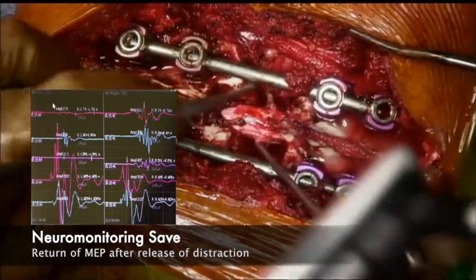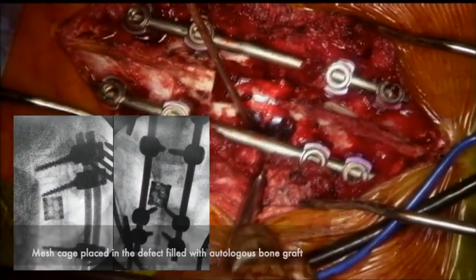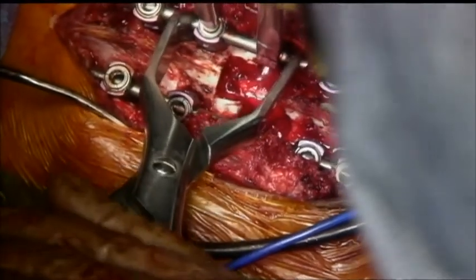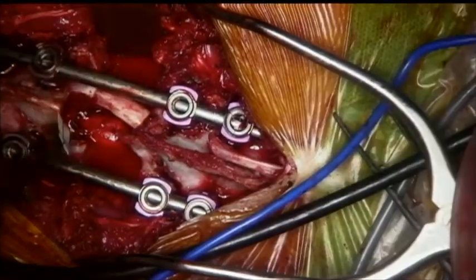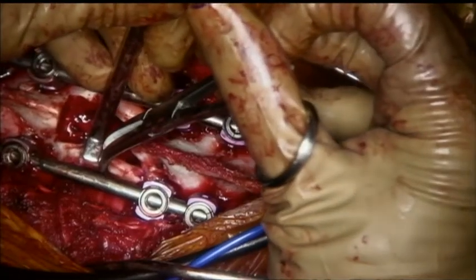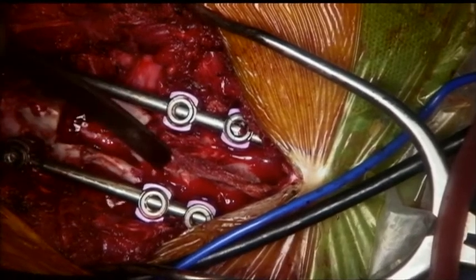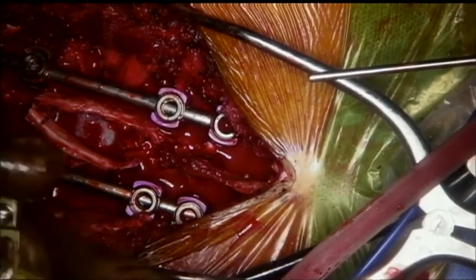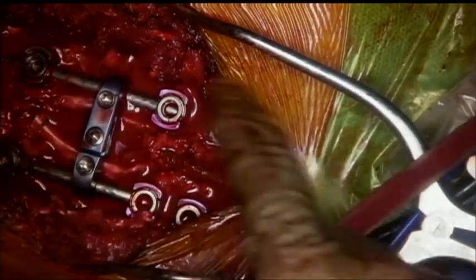We checked for any compression on the dural sac during this maneuvering. A mesh cage filled with autologous bone graft is placed in the defect and its position is confirmed on the C-arm. Compression is applied across the screws to lock the cage in. The posterior column is reconstructed using the harvested ribs to restore continuity of the posterior elements. Posterior elements are then decorticated from T3 to T8. Rib grafts are placed longitudinally across the defect, a cross-link connector is applied, and the remaining harvested bone graft is placed over the decorticated posterior elements.